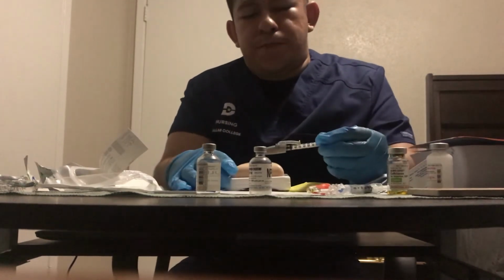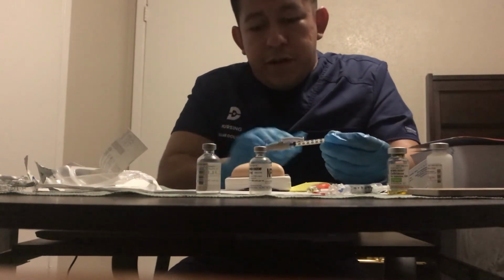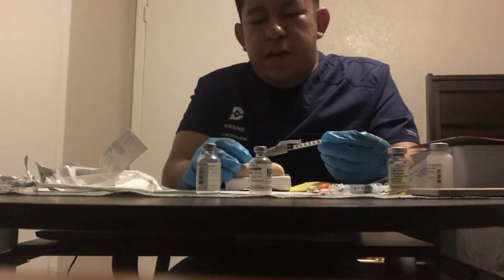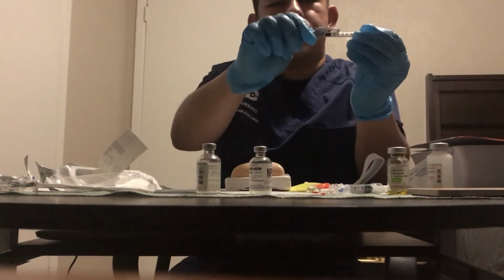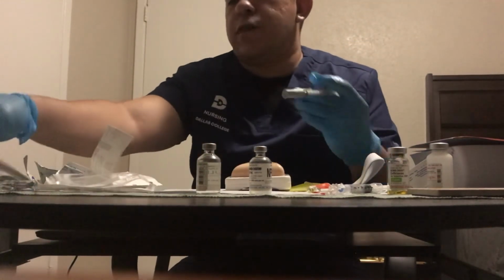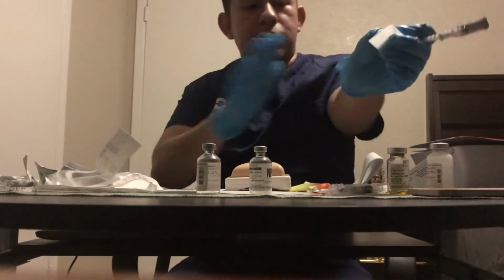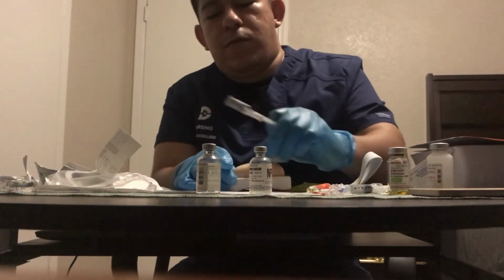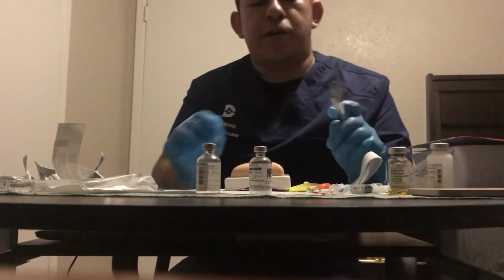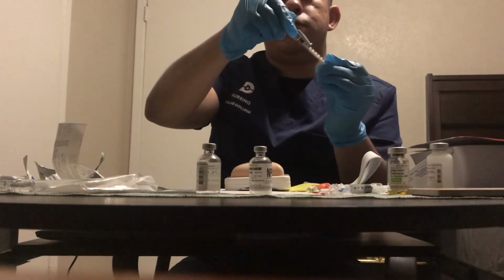What you want to do is you're going to go at a slight angle, just a little more than the surface level, just so you can create this bleb. So the way we will do that is you will grab your alcohol wipe. You will give this on the forearm. Wipe the area, let it dry. Once it's dry, take the cap off.